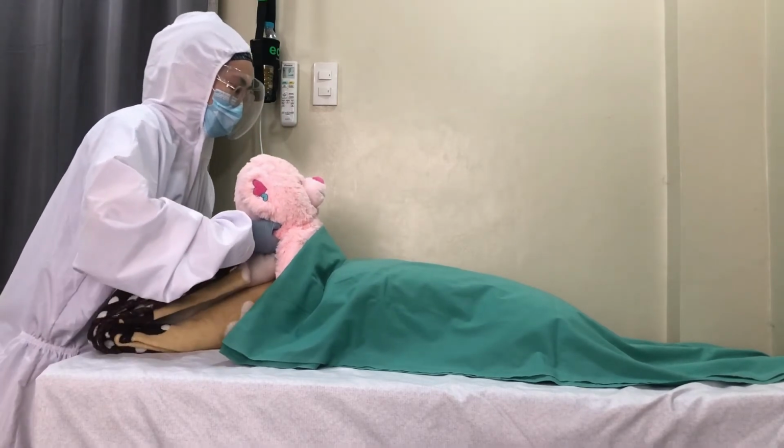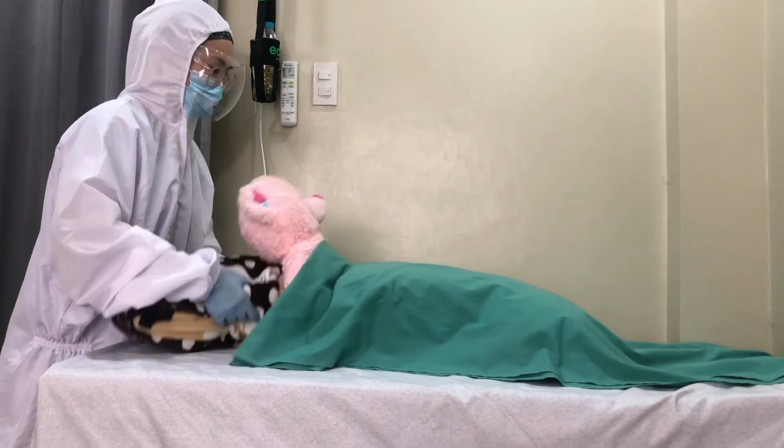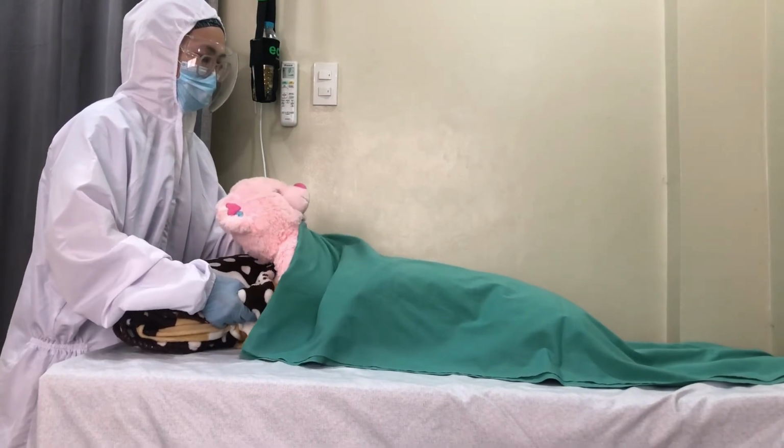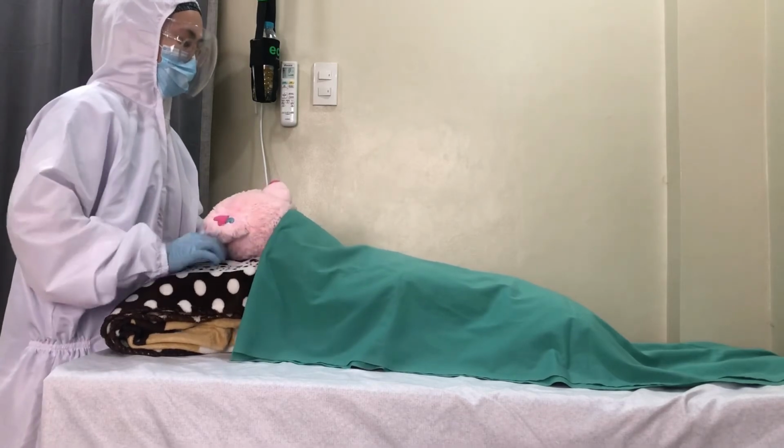We will reposition the patient in a ramped or head-elevated laryngoscopy position, or HELP. This improves the view during direct laryngoscopy so that successful endotracheal intubation can be achieved more rapidly.